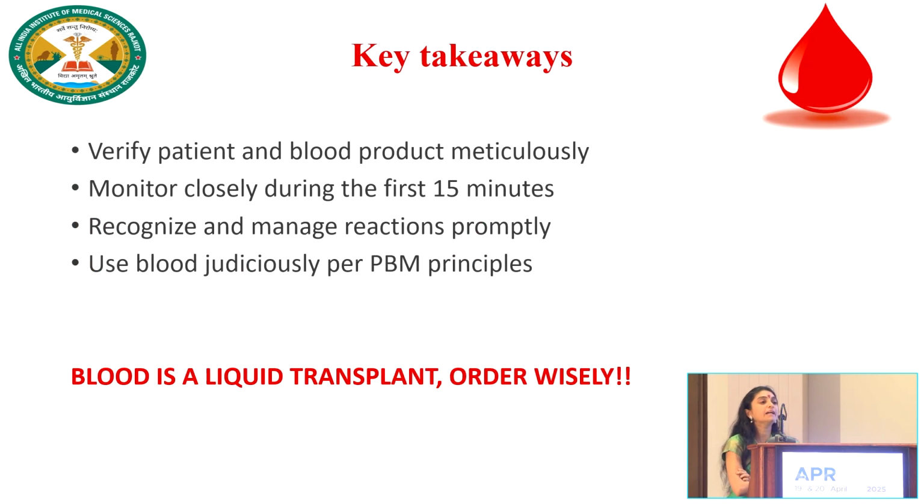So, key takeaways from my perspective: verify the patient and the blood product given meticulously, closely monitor during the first 15 minutes of transfusion, that is when most of the transfusion reactions will be noticed. Recognize and manage the reactions promptly. Do involve the blood bank team along with that to help you better understand the consequences of transfusion reactions, and use blood judiciously as per the patient blood management principles.